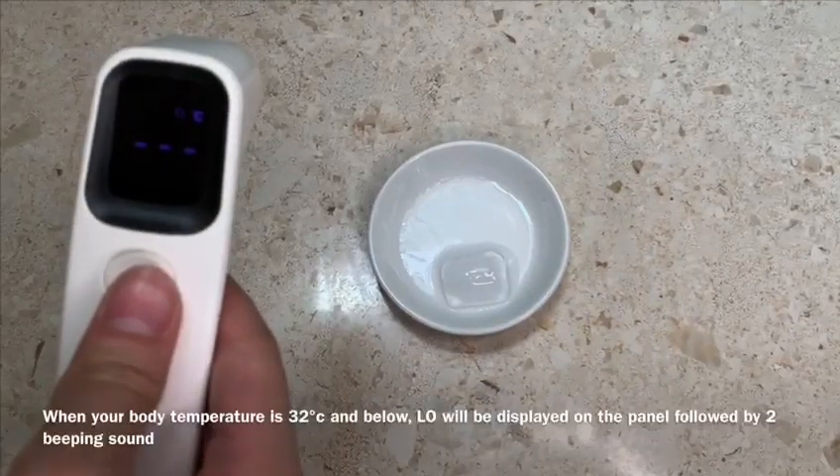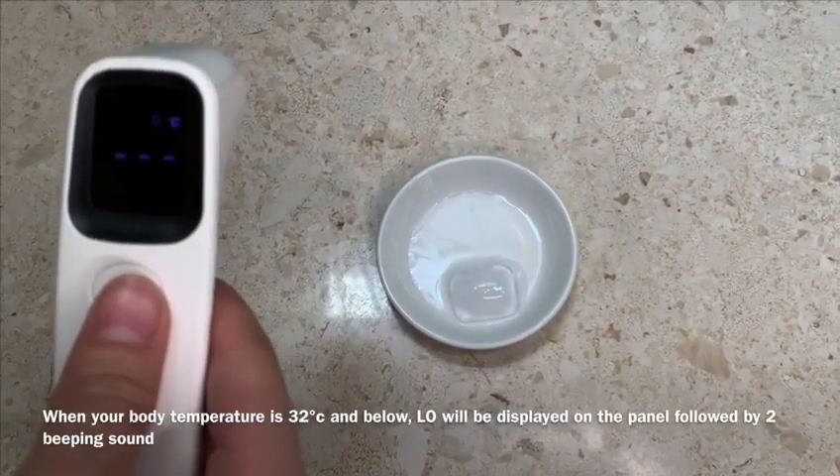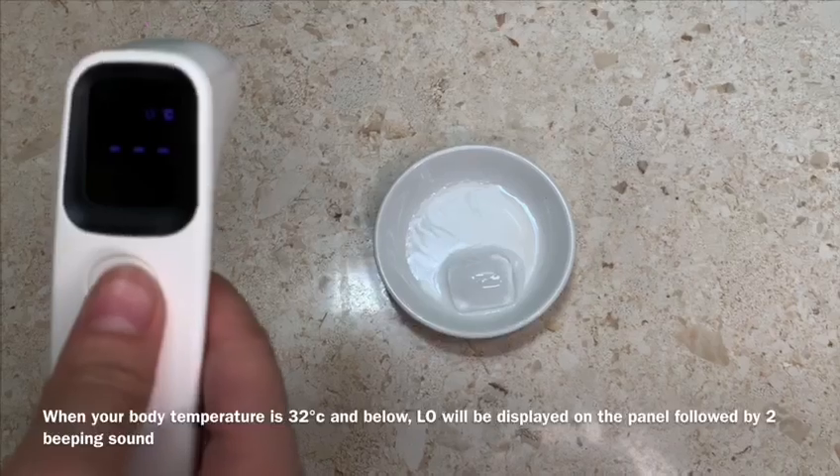When your body temperature is 32 degrees and below, 'low' will be displayed on the panel, accompanied by two beeping sounds.